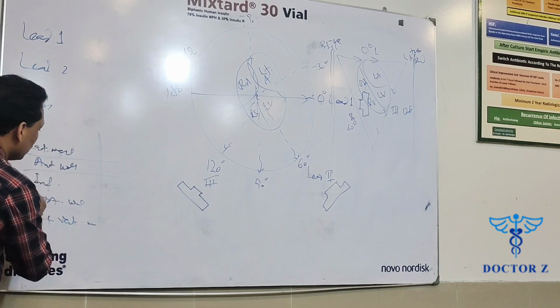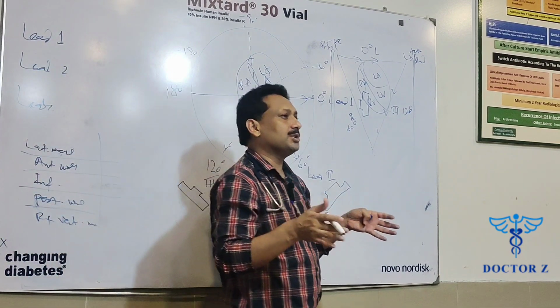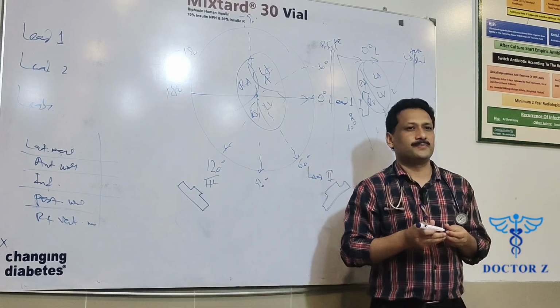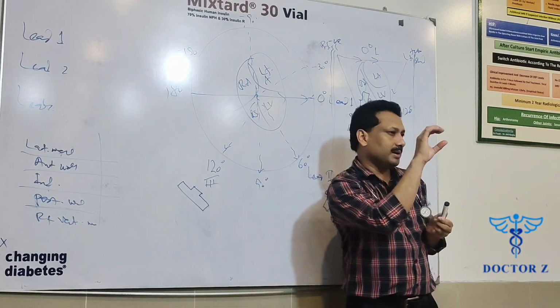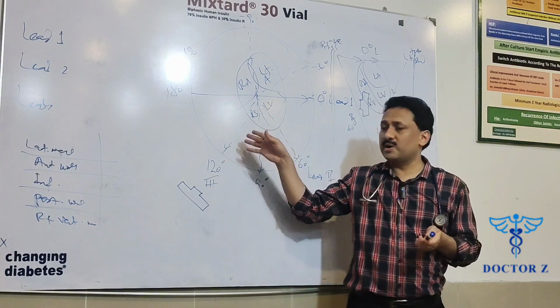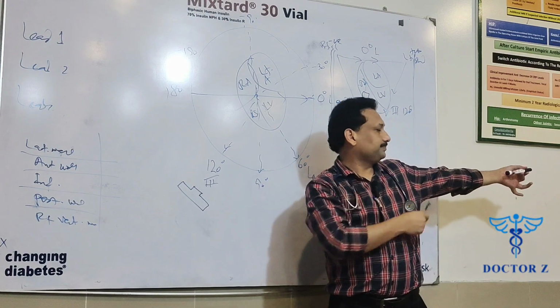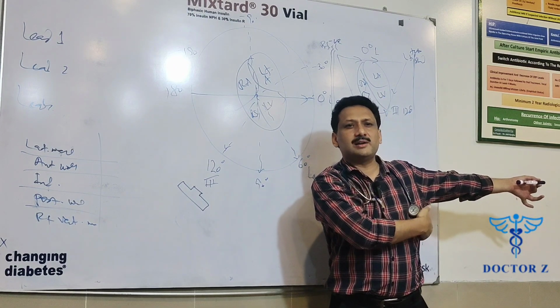And we just want to learn, if I want to know the information hidden in these walls with the aid of that ECG paper, what I should do. So this is what I should do. Now see what's happening here. I have placed one camera here. That camera is seeing my lateral wall.